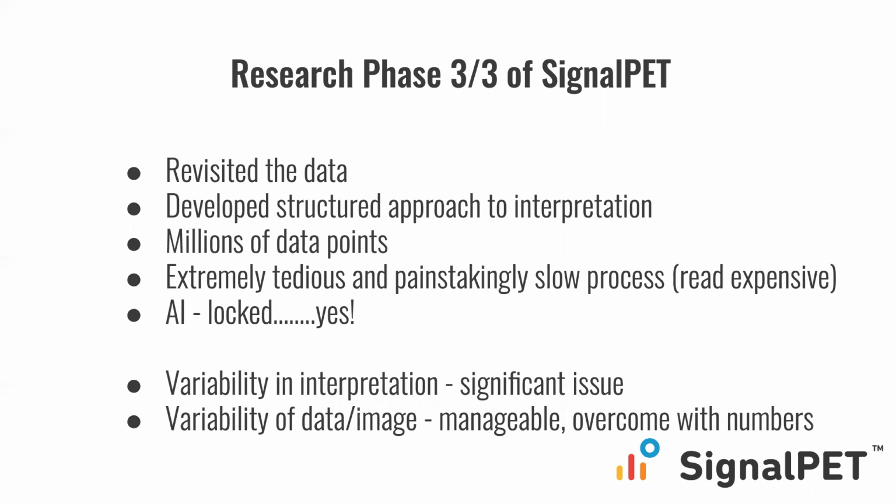So the quality of the film wasn't as significant as the quality of the interpretation. And when we focused on providing consistent, objective, concise interpretations, the system was able to learn, and the system learned well. And it was successful.